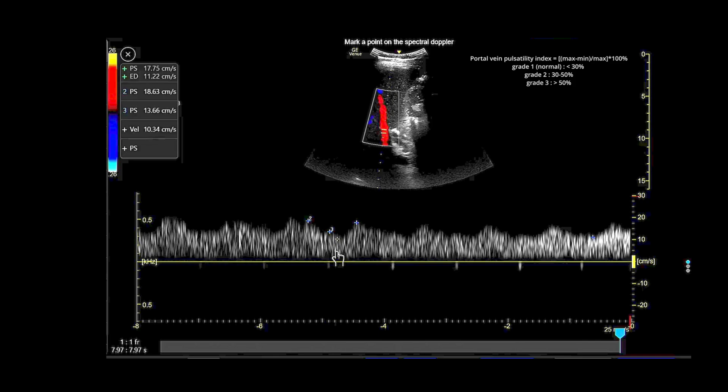In this image, the Vmax is 18.63 and the Vmin is 13.66, from which we can calculate the PVPF.